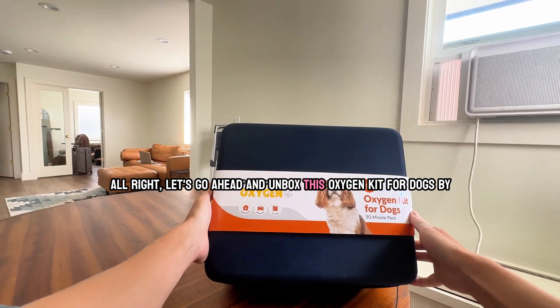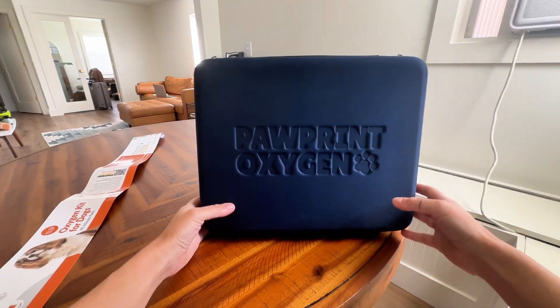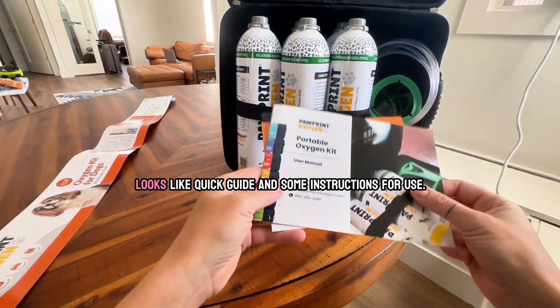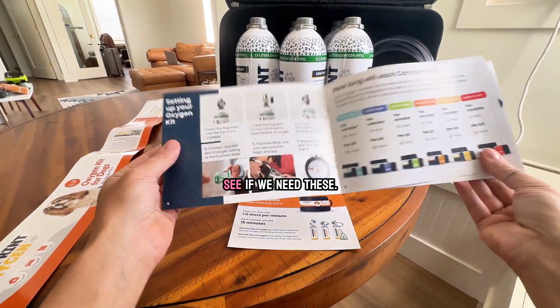Let's go ahead and unbox this Oxygen Kit for Dogs by Pawprint Oxygen. Lift it up so you can see what's inside. This looks like a quick guide and some instructions for use. Let's see if we need these.